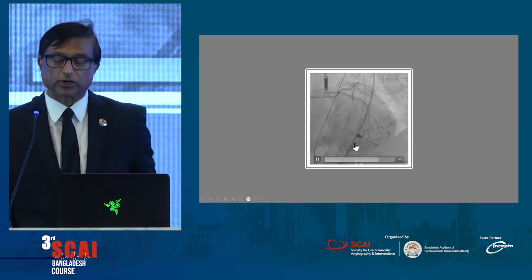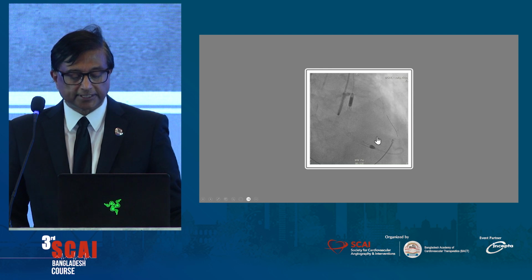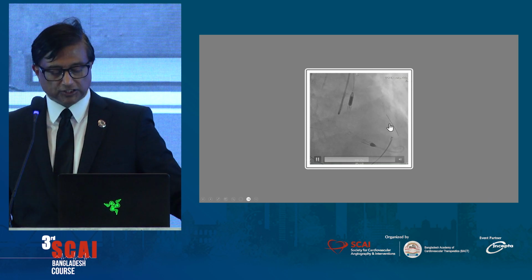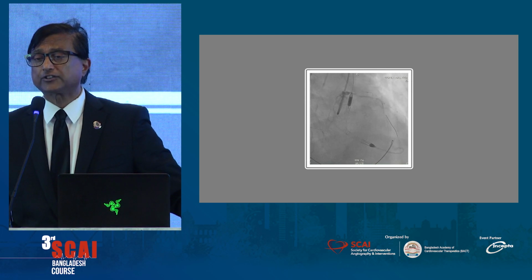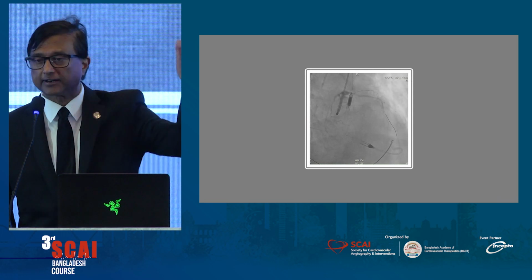So in this case, the patient's LVEF was bad and EDP was high, so we did some mechanical support. As you know, in the cath lab, we actually make things worse to ultimately get things better.